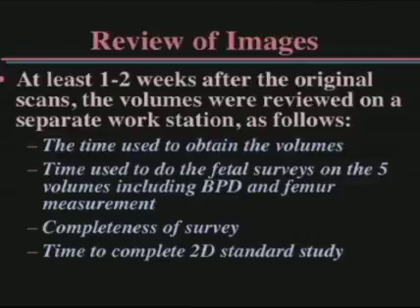A couple of weeks after the original scans, the volumes were reviewed on a separate workstation. We looked at the time it took to obtain the volumes and the time it took to do the surveys offline. We timed ourselves doing the surveys offline on the 5 volumes, including measuring the BPD and the femur. We looked at the completeness of the survey: were we able to identify all of the landmarks?